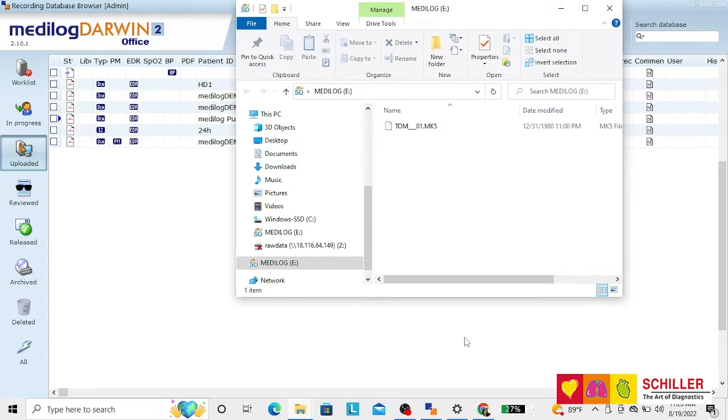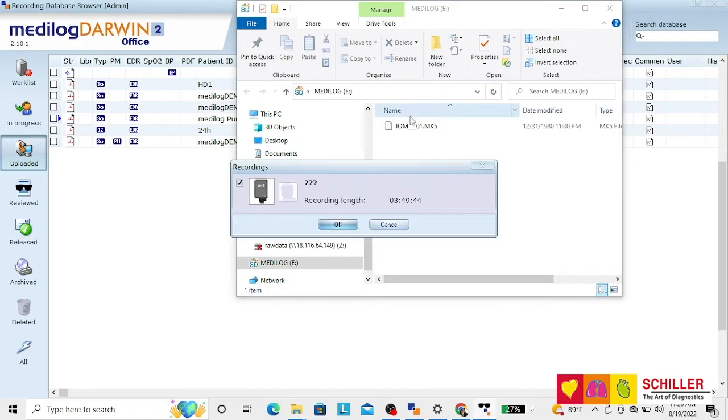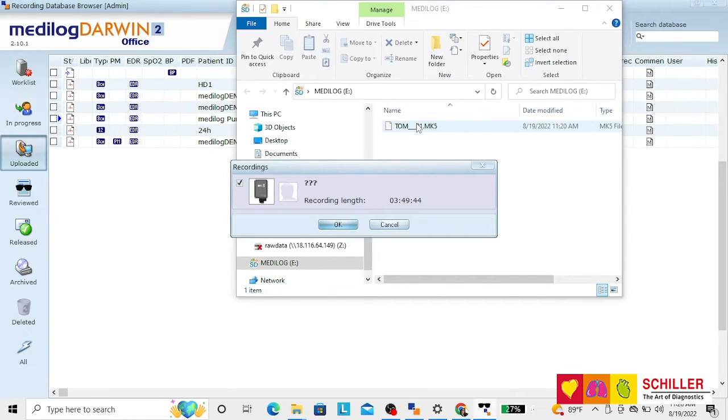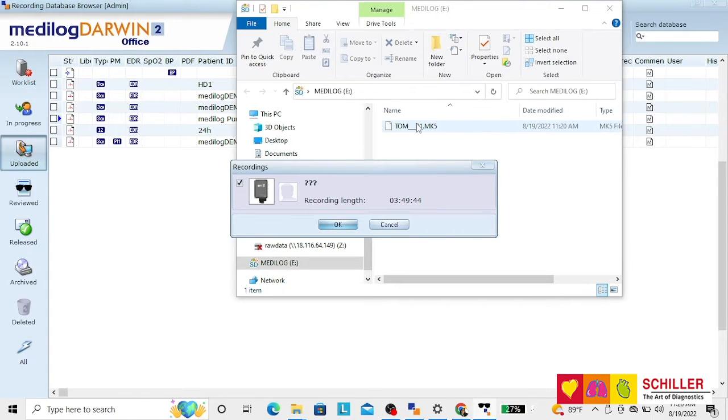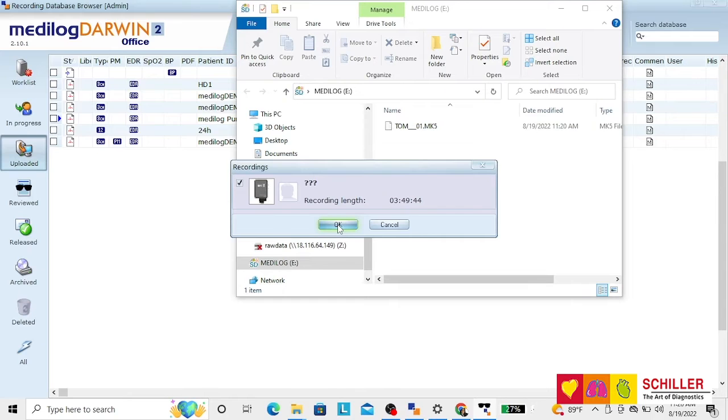You will see that it opens a recording, and a program that's already installed called the Observer will detect a recording there and will tell you if there is an adequate recording or not.